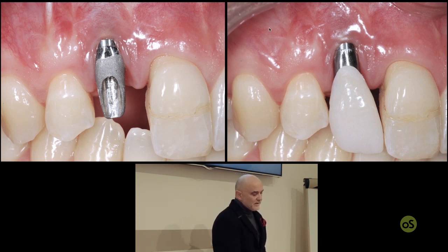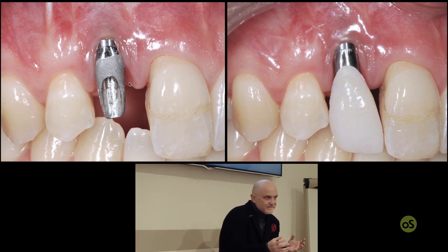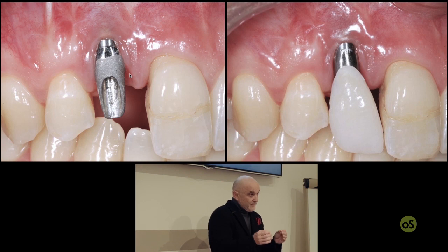And if you see that during this phase there are areas where some of the tissue can be gained, but it's still occupied by the temporary crown, you have to further reduce the temporary crown in order to allow the soft tissue to completely fill the space.